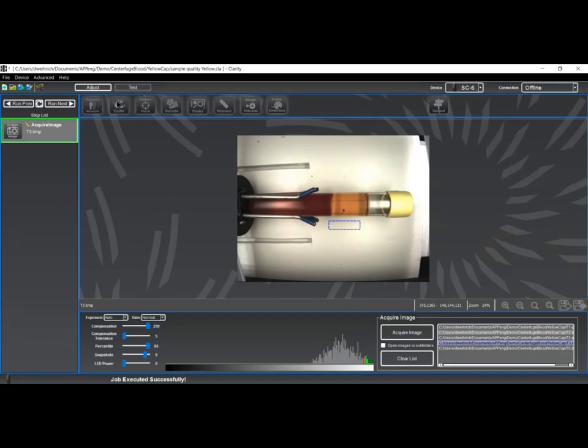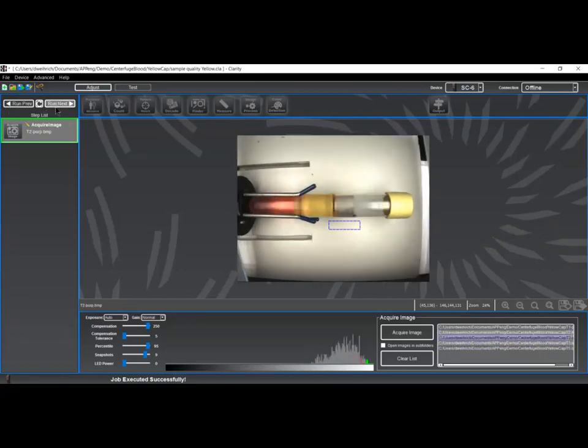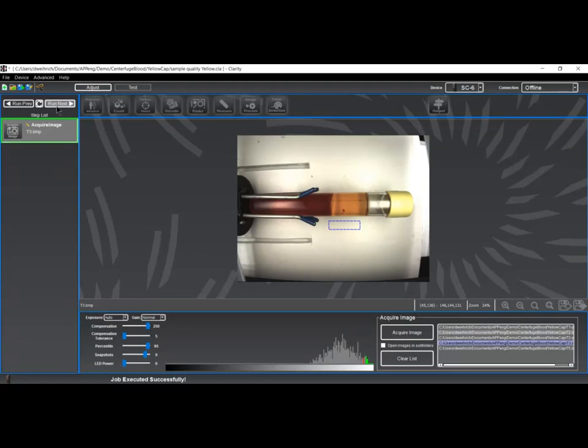Let's dig deeper then into using some of the constructs and capabilities that are offered on the Clarity scripting platform and the JADAK machine vision platforms that'll achieve our end mission of validating and measuring centrifuged blood samples. I have here a handful of representative images of some collections taken.